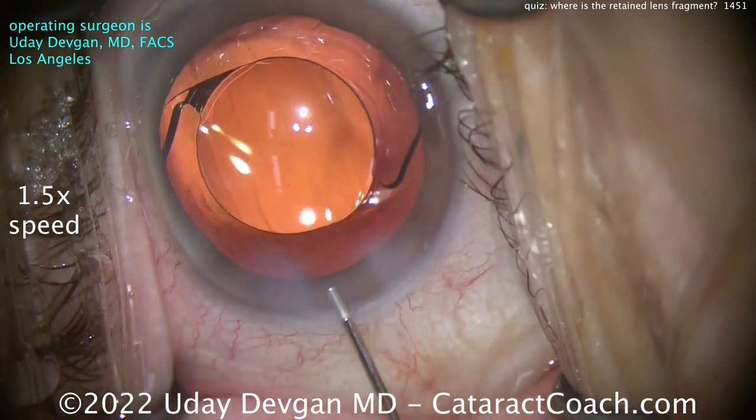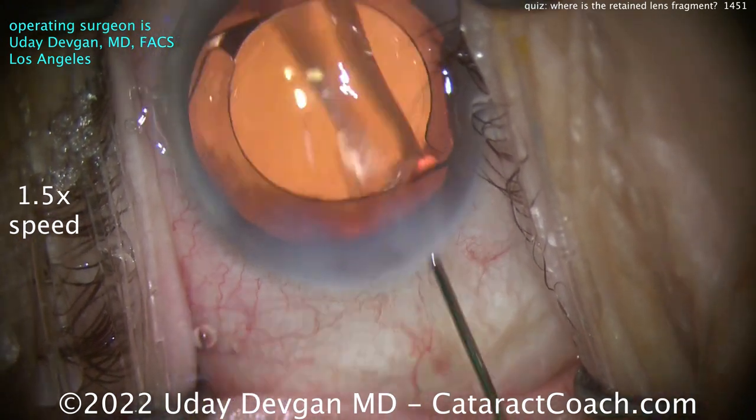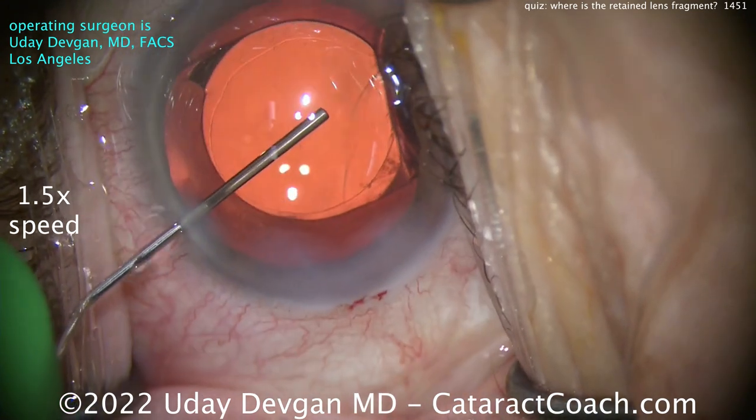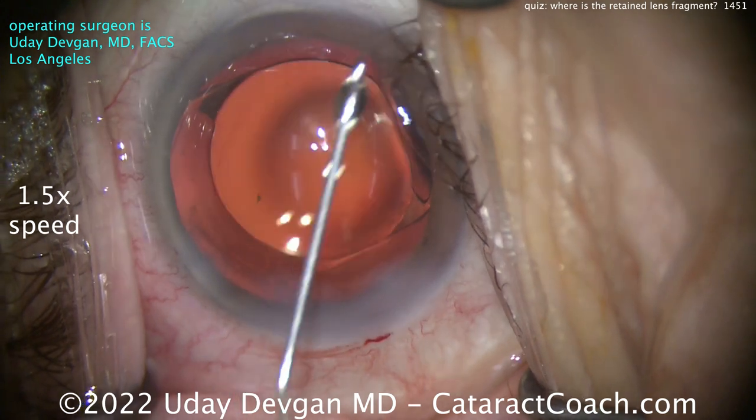Good dilation — it's not hiding under the iris. Seal up the incision, and a little viscoelastic in the eye. Let's do a little angle sweep here for viscoelastic. Yes, I know the eyelashes are irritating — I know, thanks for pointing that out.